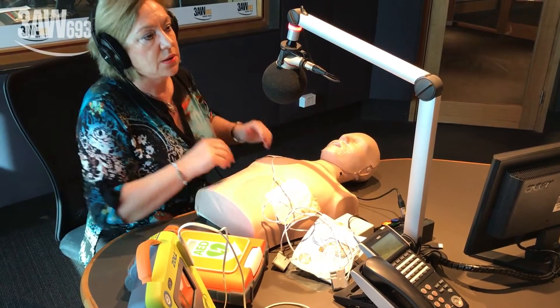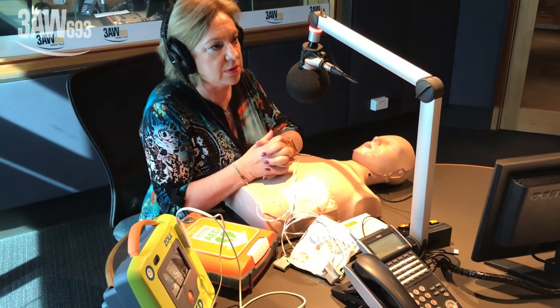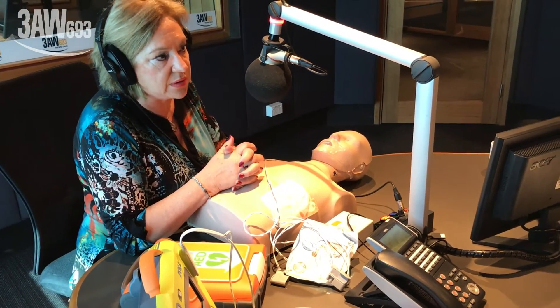What if someone from Vietnam couldn't speak English? The defibrillators are programmable for different languages. In Australia you're not likely to find one in a different language, but if you had predominantly one particular community, you could have it programmed in that language.